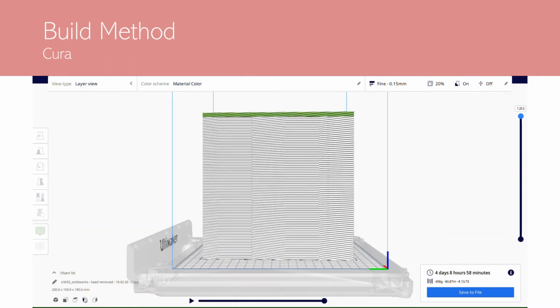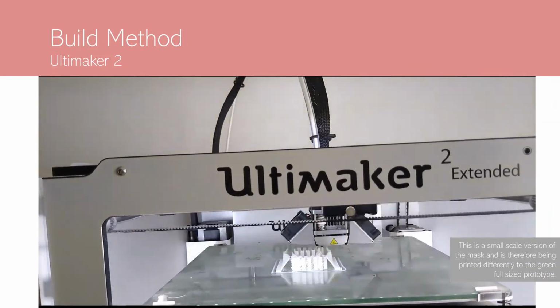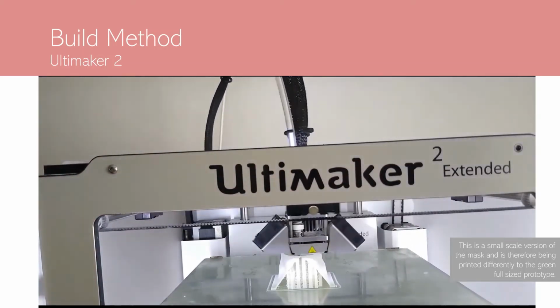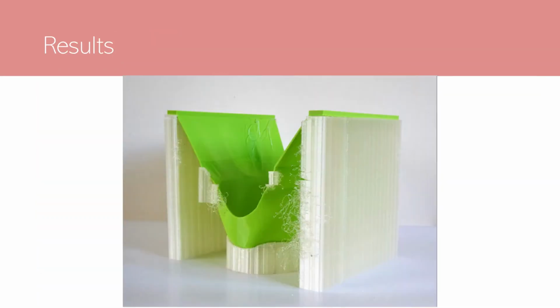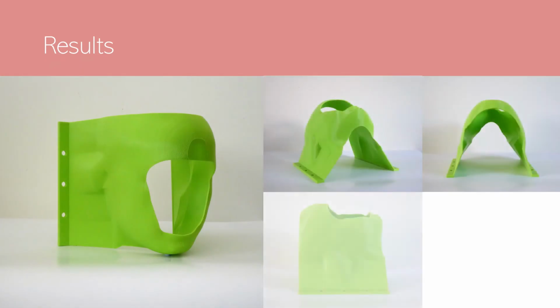The mask was orientated on the build bed face downwards to minimise the amount of support material required, and so that the support did not interfere with where the individual's face is placed. The prototype was created from ABS on an Ultimaker 2, used PLA as the support material, and took 4 days 9 hours to manufacture. From the testing, results found that the mask fit well, was comfortable, and patient movement was restricted, but to a slightly greater degree than the allowed 2 mm.